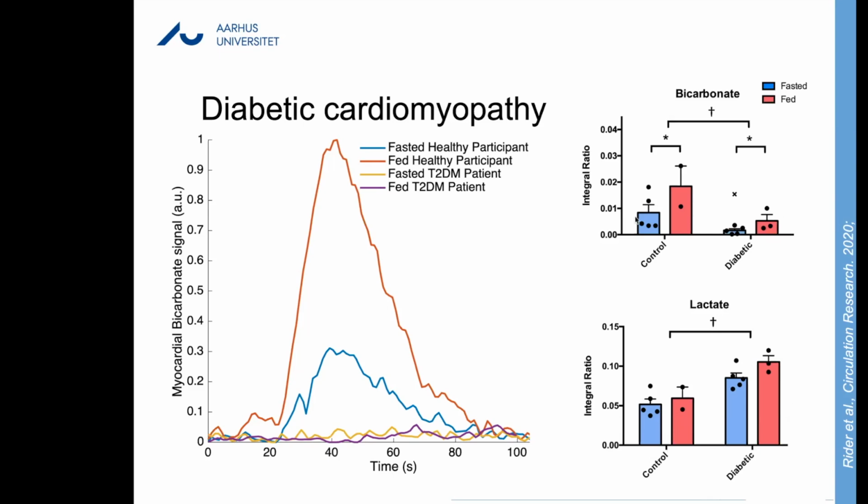So already here in this pioneering work by the Oxford group, you're seeing quite dramatic changes to the metabolism, as you would have expected, but it's nice to be able to actually extract that kind of information from the carbon data.